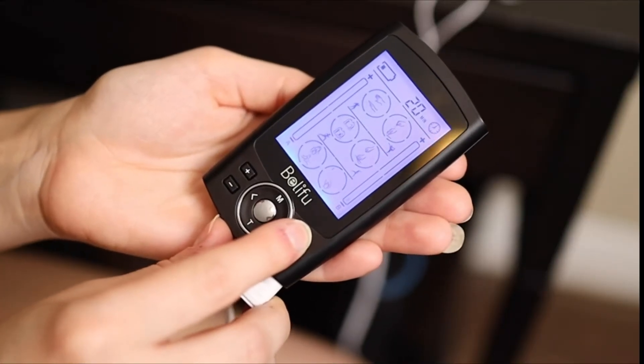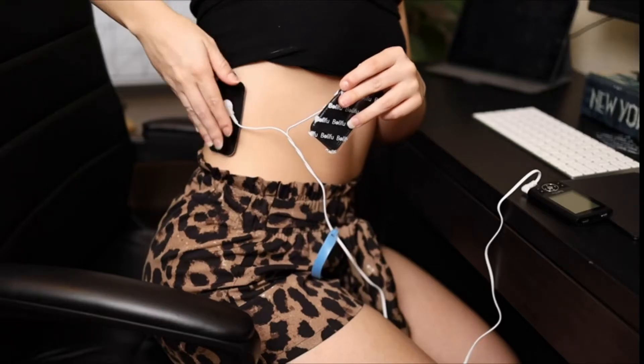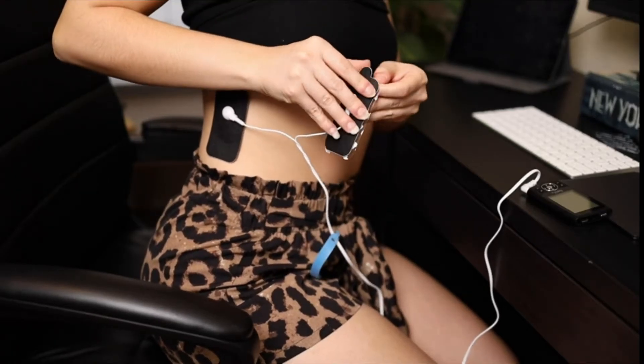There are 20 levels of intensity, so you can select the modes and intensity that you need for pain management and rehabilitation.